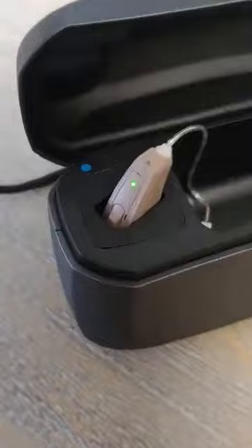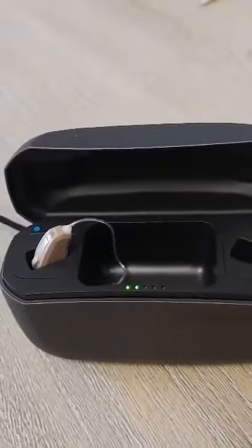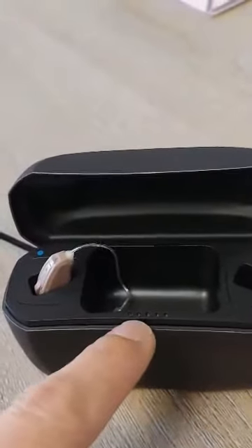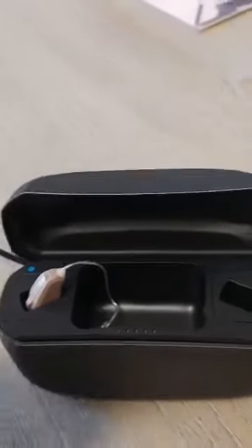You want to make sure that it's blinking green to let you know it's charging. It'll also light up on the front here to show you how much it's charged. Right now it looks like there's only a couple dots, but it will need to get up to 5 in the morning.